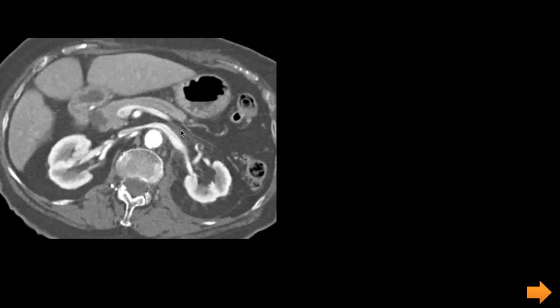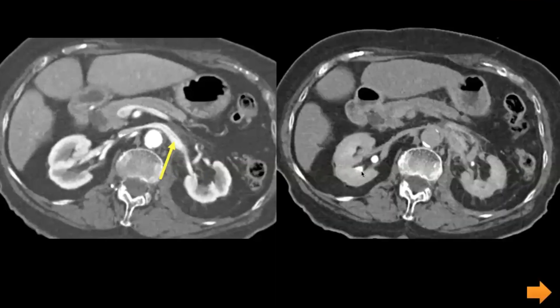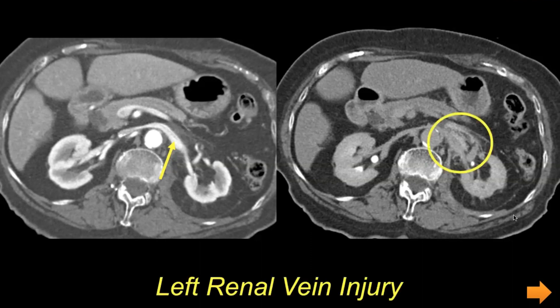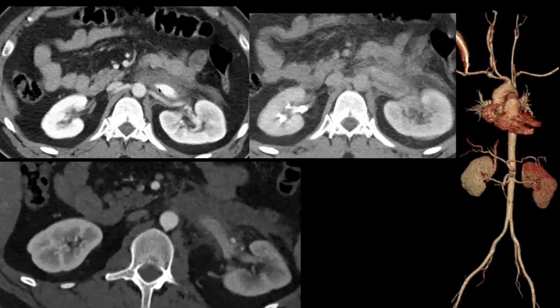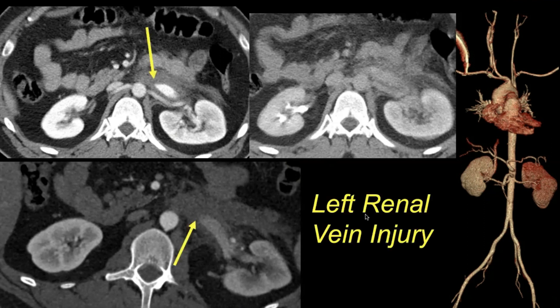Another example: status post MVA with stranding in the retroperitoneum, a filling defect in the left renal vein, and active bleed that is venous only, seen on delayed images and not appreciated on the early phase. Another more dramatic case with left renal vein injury showing occlusion with a retroperitoneal hematoma and significant delayed nephrogram as well as delayed excretion.